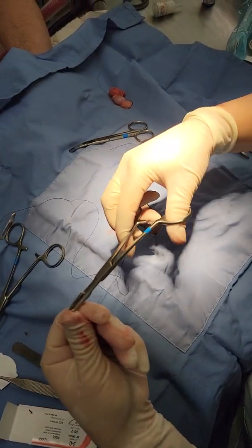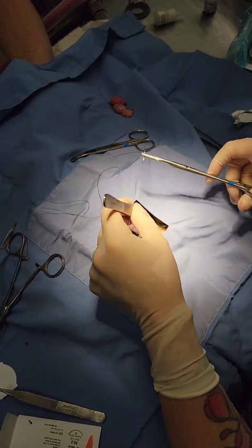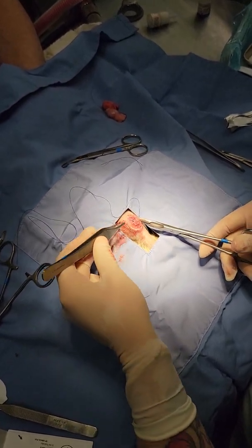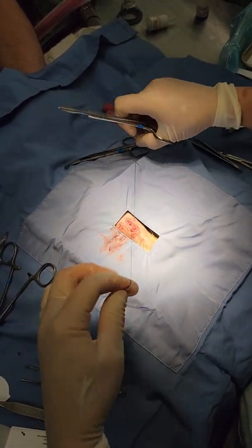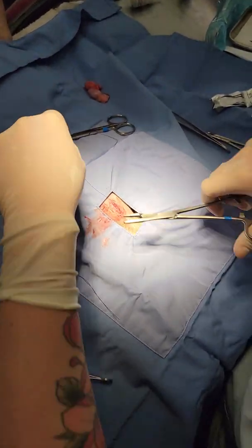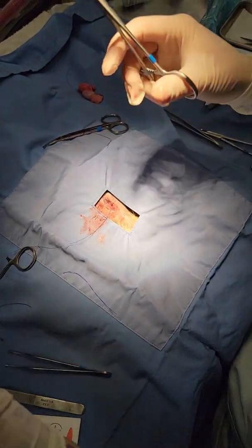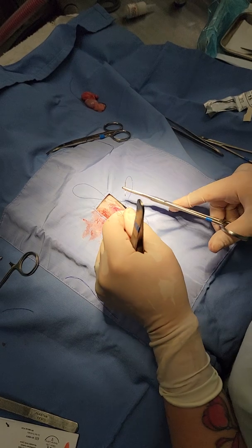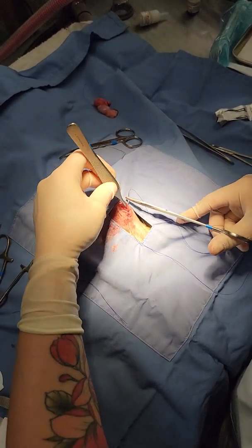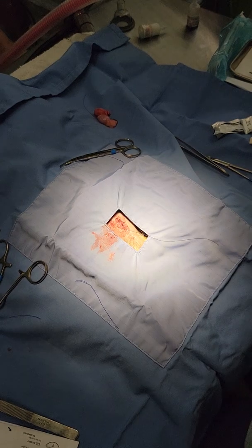I'm going to get ready to close. I don't do anything special for closing except that, again, just like when I made the incision, I'm super cautious about where I'm placing ligatures. I start at the caudal aspect — definitely make sure you're getting both sides of the body wall. I'll tend to do a simple continuous with only maybe two to three throws to close it. Then I will close the subcutaneous with an intradermal and then do just a little bit of skin glue. Post-op, these guys will get a Metacam injection as well as some fluids. I did forget to mention we had already cleaned out their mouth — super important with these guys. Since I'm kind of blind closing here, I'm going to grab this and lift up and just check everything and make sure I don't have any colon or any part of small intestine.